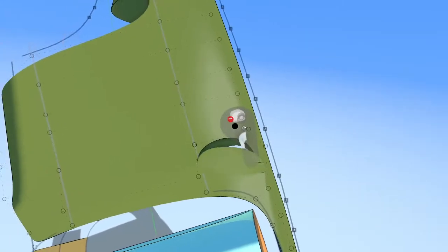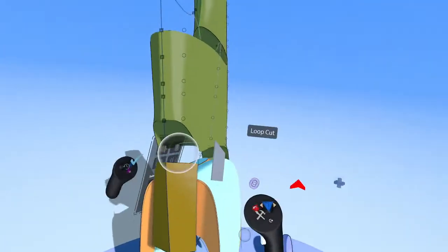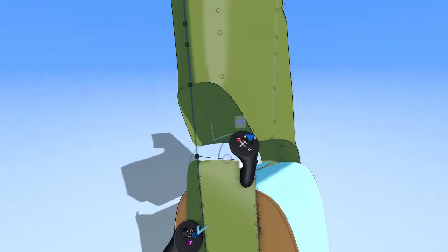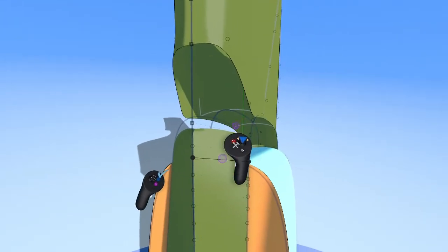One, two, three, four. Let's patch that hole. Add this shape here, and just in a second, guys, I'm going to check out questions. So if you have anything, drop it in there.